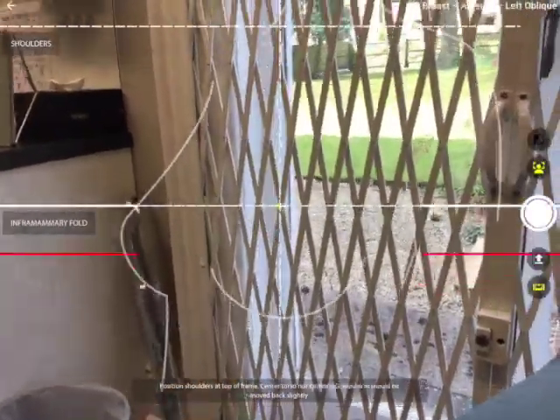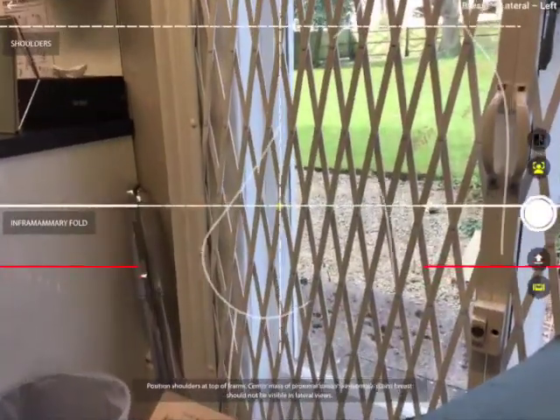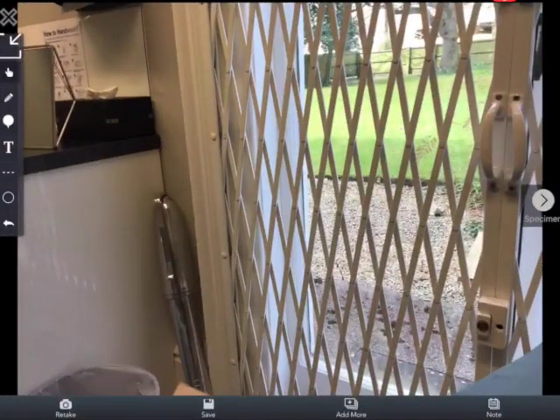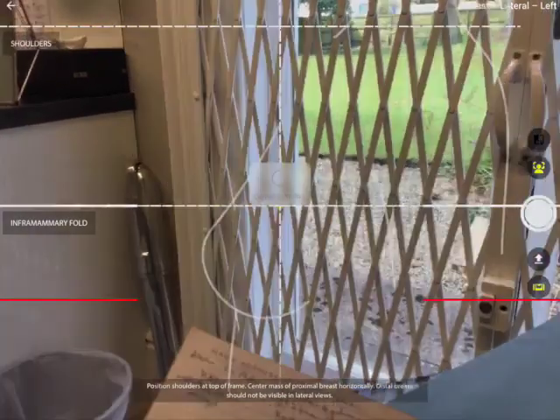So these are all programmed in, but if you think I don't want to do them in that order, that's fine. Well, first of all, if you think actually that was an anterior, but I want to do another anterior, you can click on add more and take another photo. Well, we're on left lateral, so take another photo of the same view.